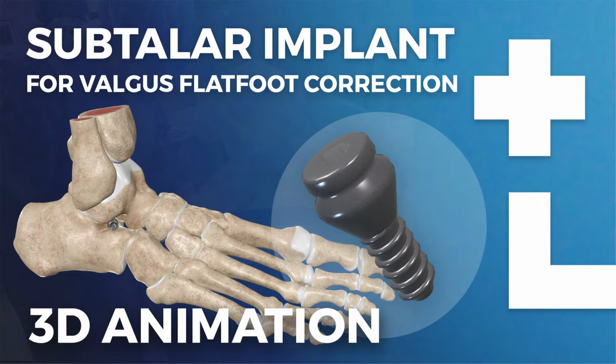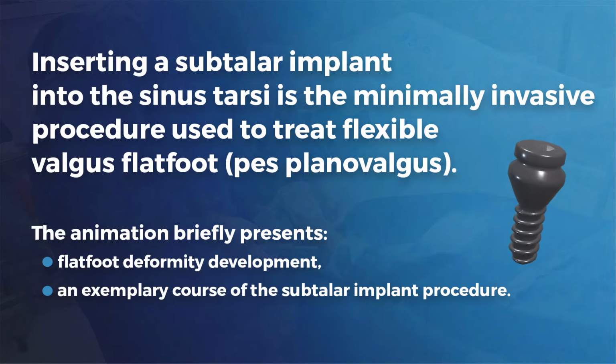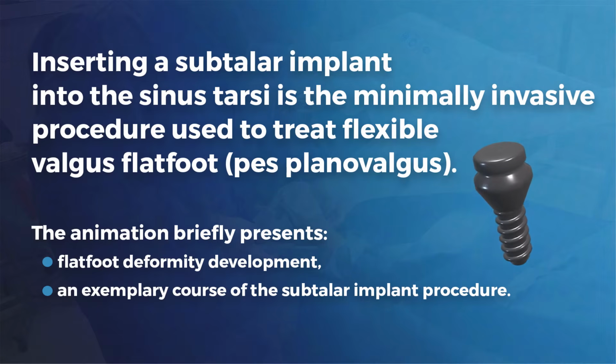Subtalar implant procedure for valgus flatfoot correction, 3D animation, Dworska Hospital. Inserting a subtalar implant into the sinus tarsi is the minimally invasive procedure used to treat flexible valgus flatfoot. This animation briefly presents flatfoot deformity development and an exemplary course of the subtalar implant procedure.